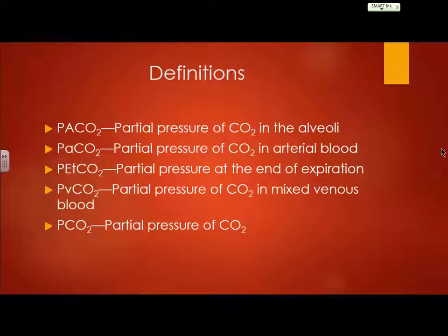All right, so I'm not going to spend a lot of time on these partial pressure definitions here simply because we went over these before, and the main ones that I want you to know for this lecture are the PETCO2 and the PaCO2. Now, one of the things you will notice is that both of these are the same letters, but this is a capitalized A, so this is actually the partial pressure of CO2 in the alveoli. All right?